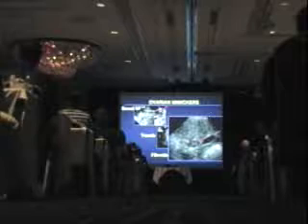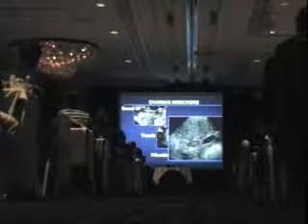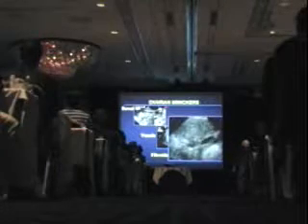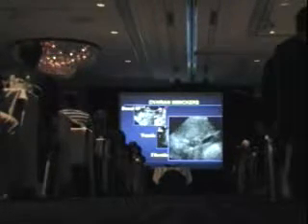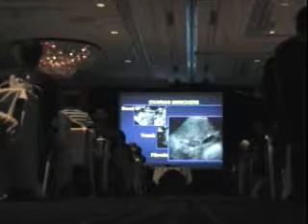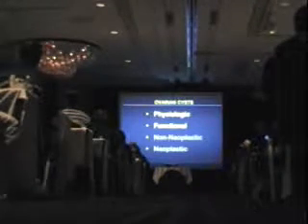This is the most problematic case. That really does look like an ovary, and it's right by the iliac vasculature. But you're pushing, as we saw earlier today in Dr. Dubilay's talk, with the ectopic moving away from the ovary. Well, that thing stays with the uterus. This is a small fibroid sticking off the edge, a subserosal fibroid. Look harder to find the ovary. The ovary undergoes lots of changes, both normally and abnormally.